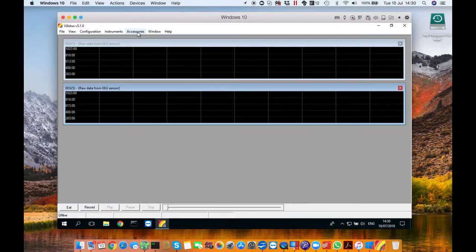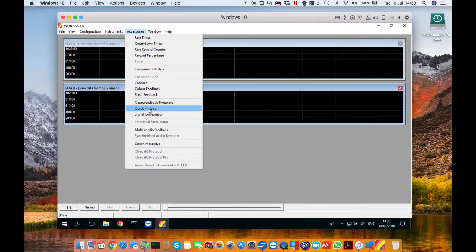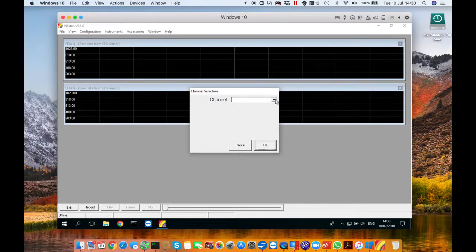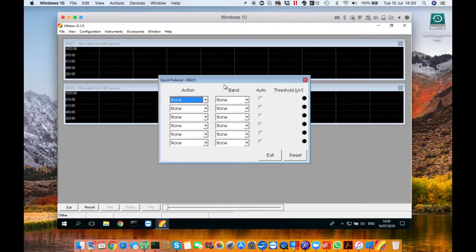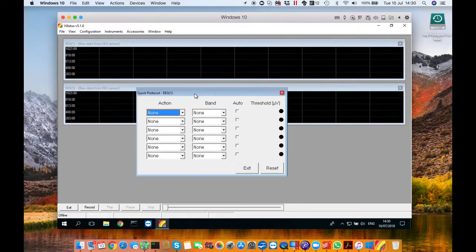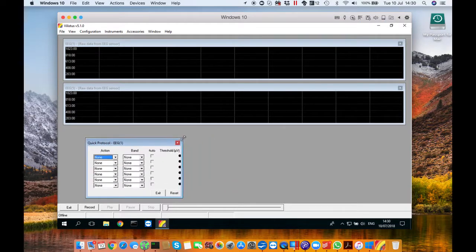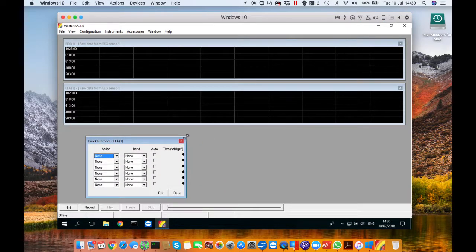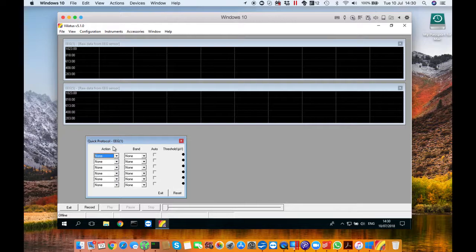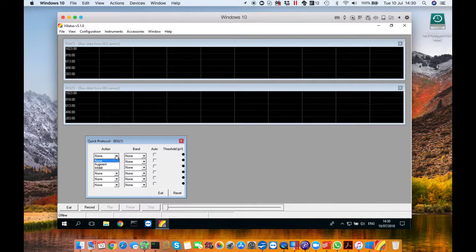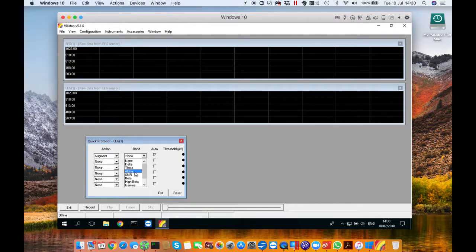Next go to accessories go down to quick protocol and then this window with the same channel will open up. Go to sensor one EEG and press OK. You'll have this little window saying quick protocol come up. You can resize it and place it in the left hand corner. This is actually where we configure the quick protocol to target your alpha brainwaves. So go to action select augment then go to band and select alpha.